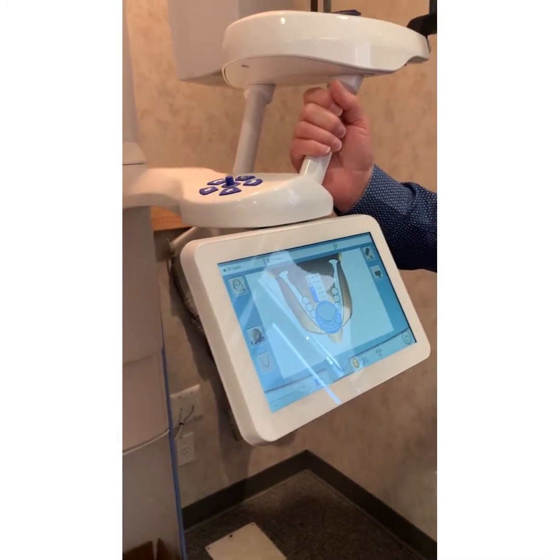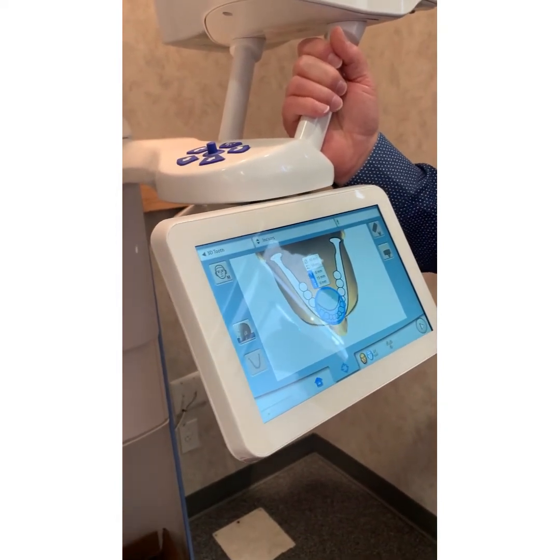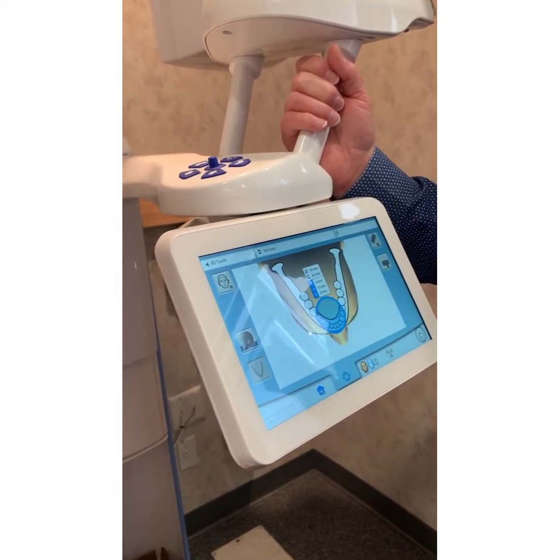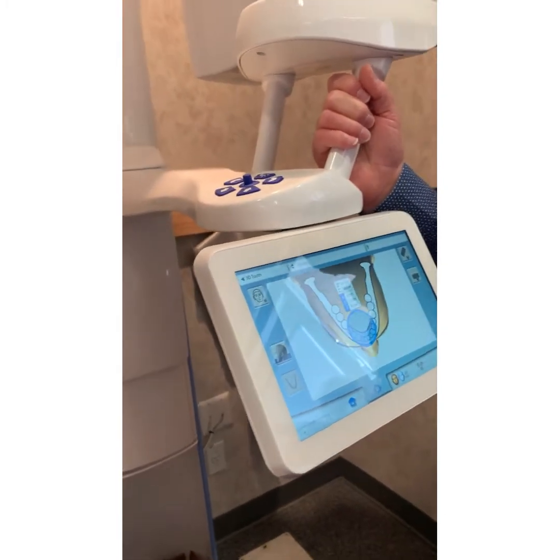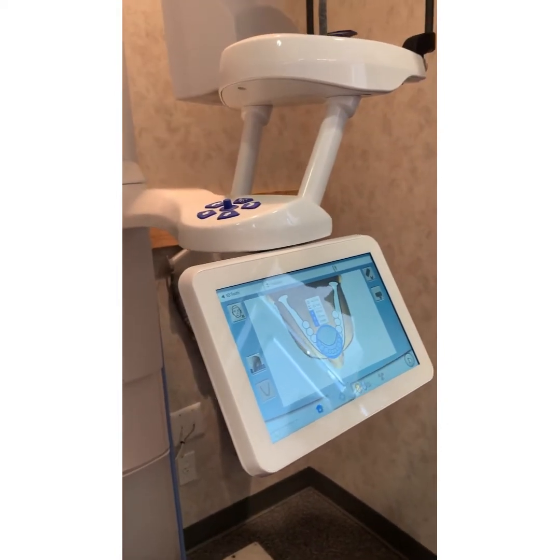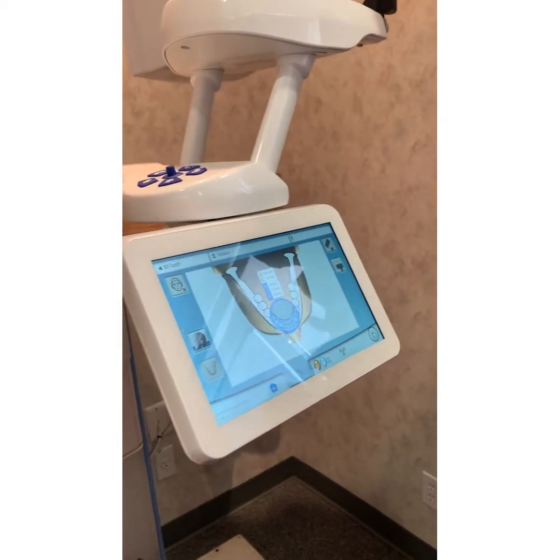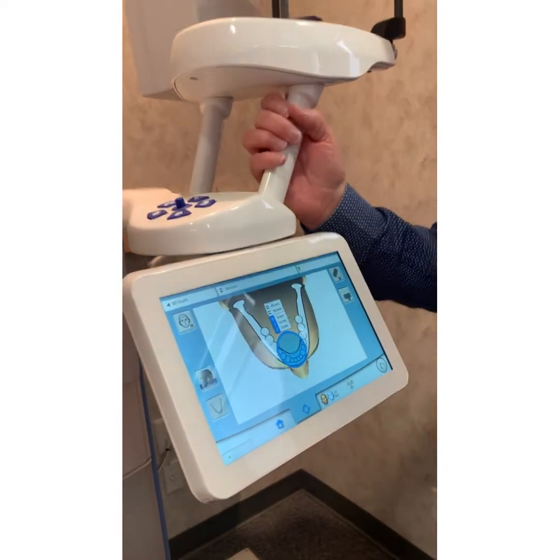Now there are a lot of manufacturers that have a scout. Before it was kind of unique to us, but we didn't have scouts back in 2009, I think, and that was a big problem for teams. People would send their 3D units back because they were tired of having to explain to the patient, "I'm sorry, we had to dose you up 3 times." We had to do that all the time, sometimes 3 scans.